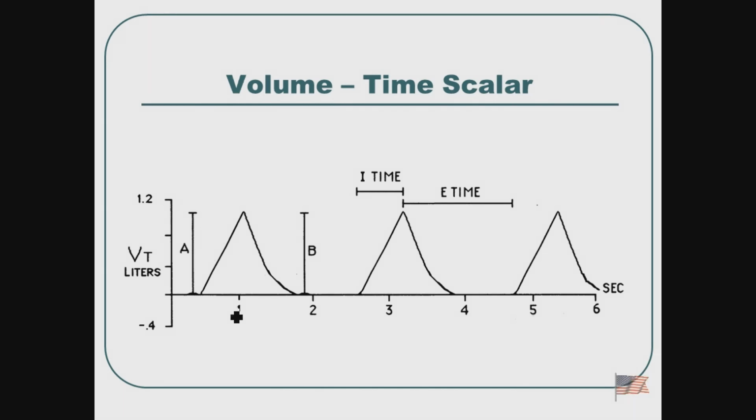And then finally, we have a volume time scalar where I end up having an inspiratory phase and an expiratory phase coming back to 0. This would be what my tidal volume would end up being. So probably about a 1 liter tidal volume, looking at that.